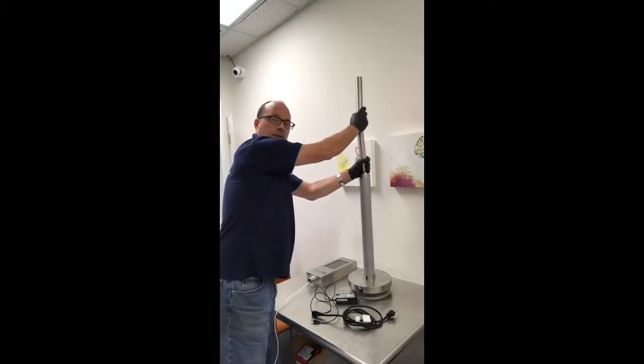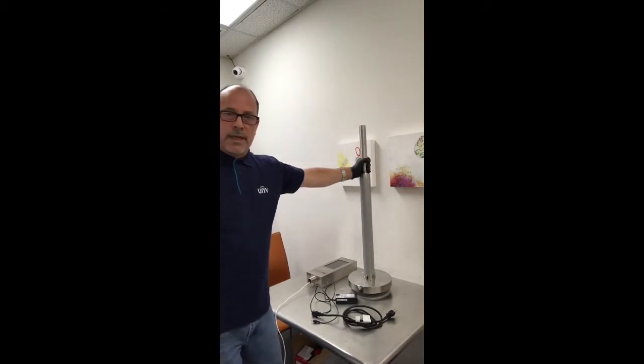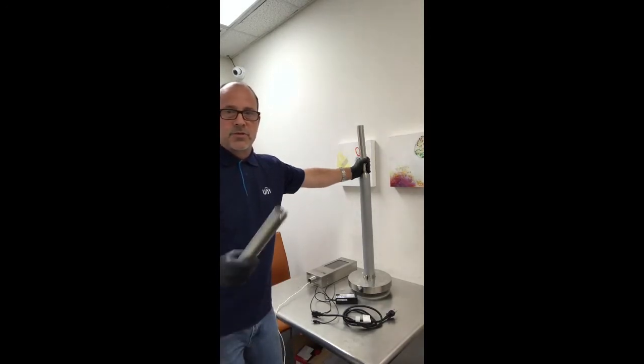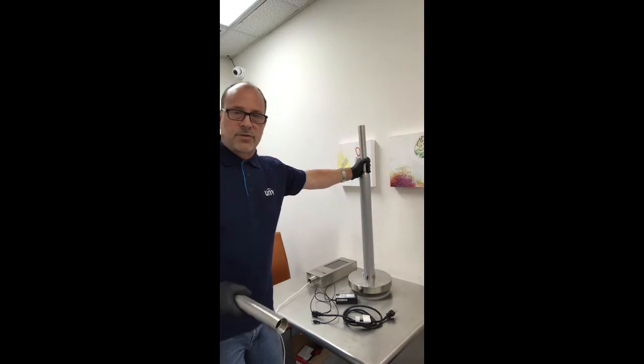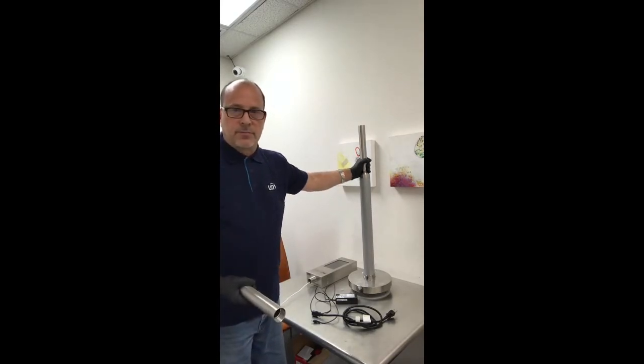Using both of the mounting poles, it's perfect to set on any flat surface and use it to read temperatures for employees entering a manufacturing facility or adults entering a large office building.